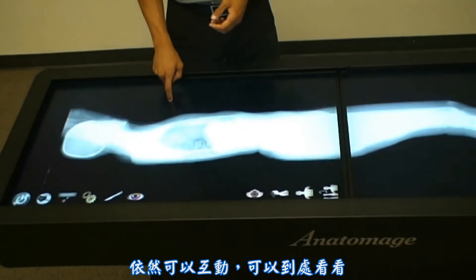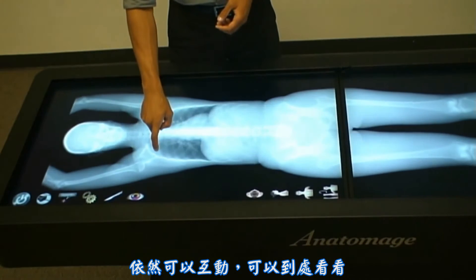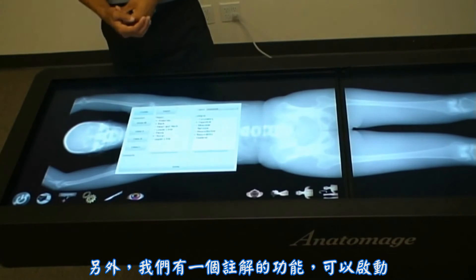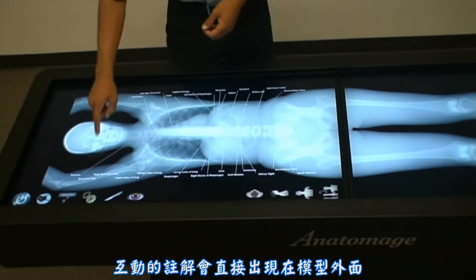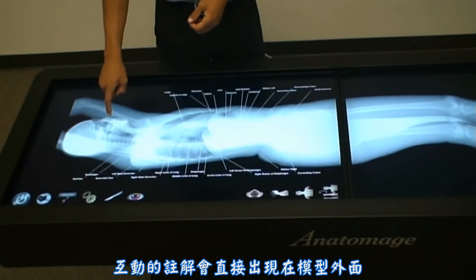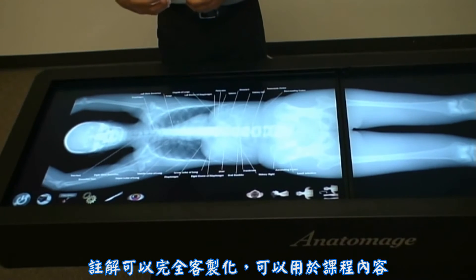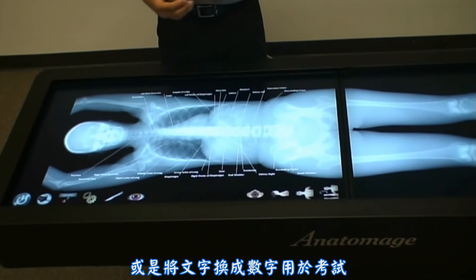And again, this is still interactive, so you can rotate around. Lastly, we have our annotation feature. We're able to turn on interactive annotations directly onto the volume. These annotations are fully customizable, so you can have them catered to a specific course or replace all the text with numbers for an examination.